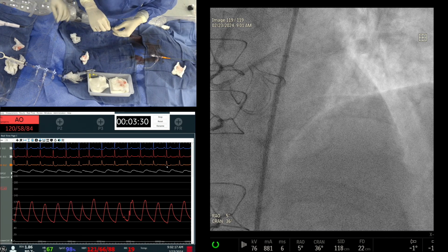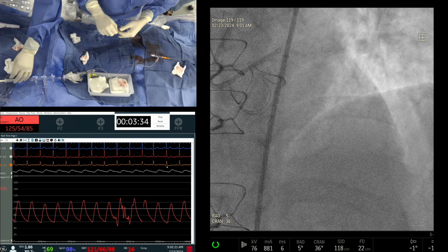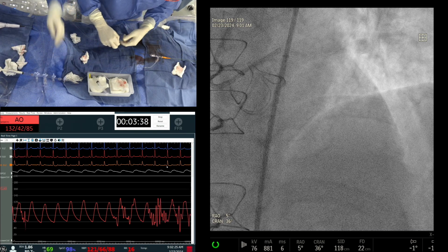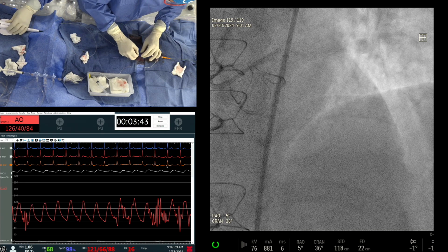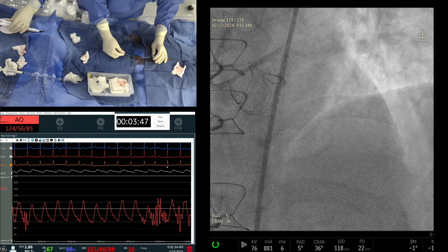But you saw that in the RotaCut trial, of the 60 patients, there were no complications. 2 patients had a non-Q MI, that's it. 60 complex cases. I think in the history of rotational atherectomy, having almost no complication except this moderate CK release in 2 patients was remarkable.